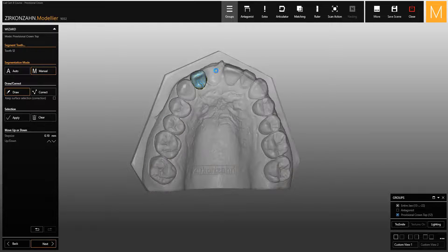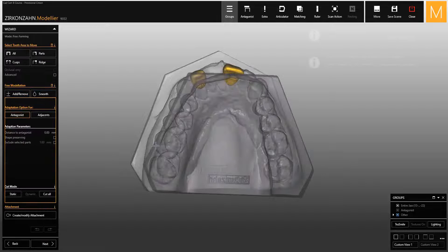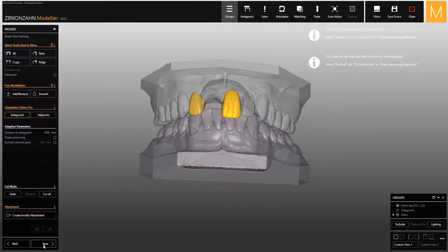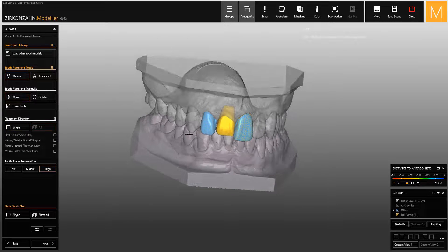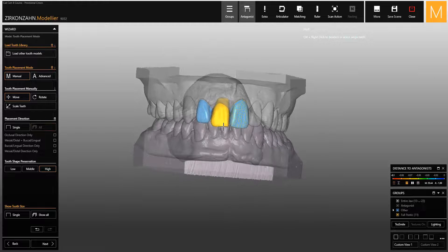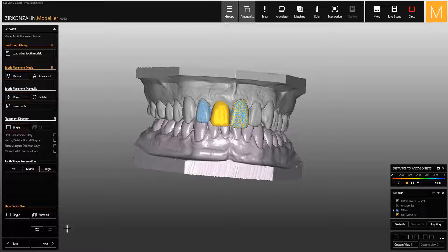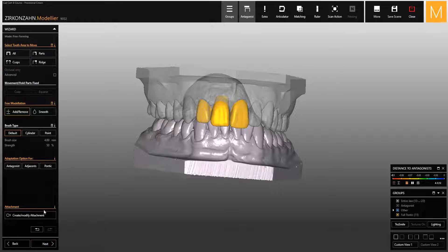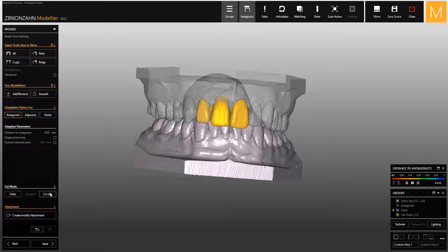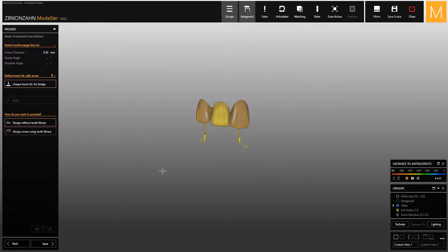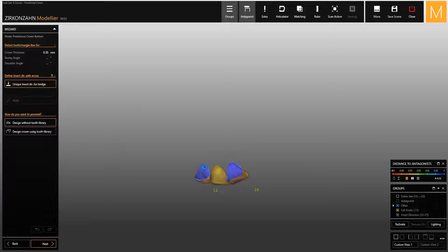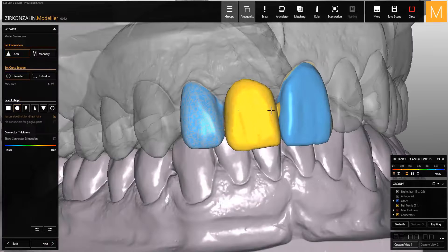If you go back to the wizard, you will see that the two eggshell pontics are now displayed as anatomic. A tooth library has also been uploaded, and you can adapt the teeth to the gingiva as usual. Now you can continue your design and finalize the temporary restoration.